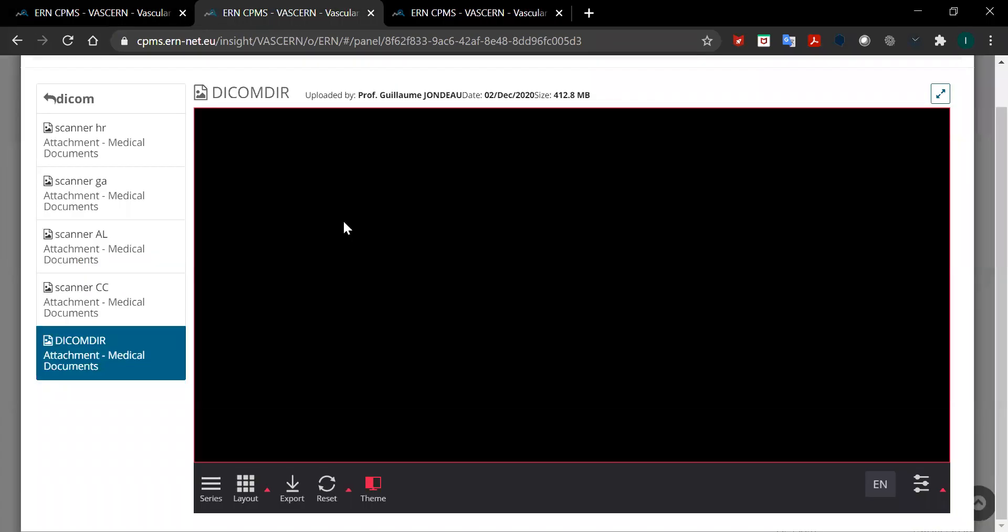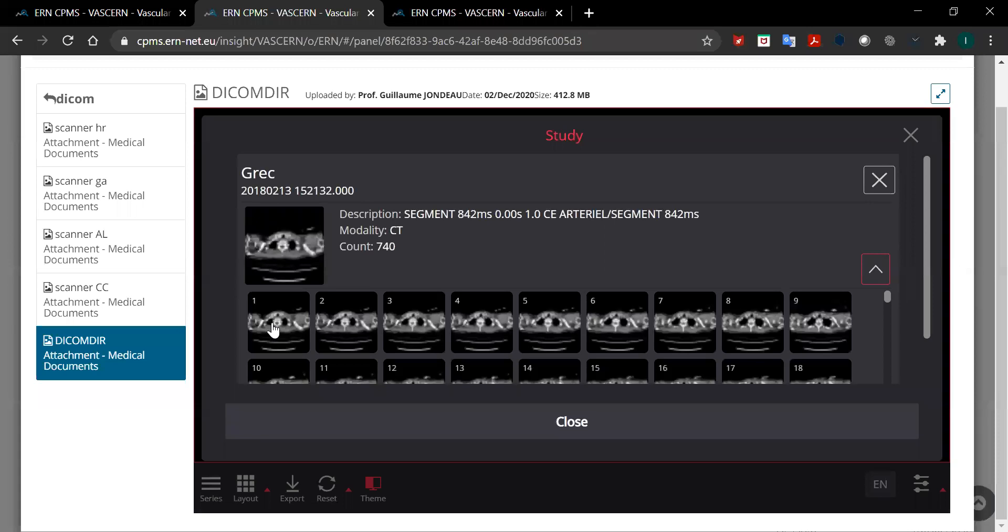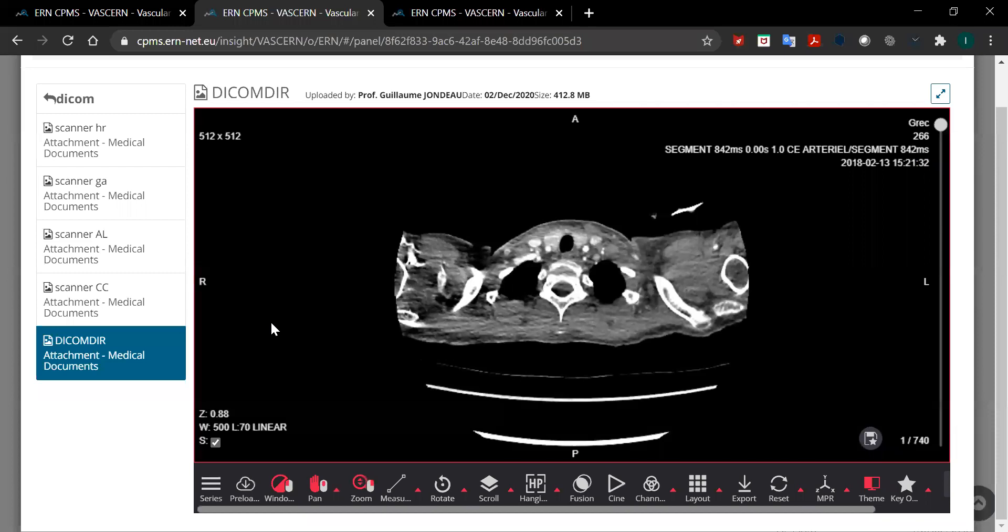From this page you need to select which file you would like to download. In order to do that, click on series and click on this arrow here and select the file. You can select the first image or any other image for that matter.